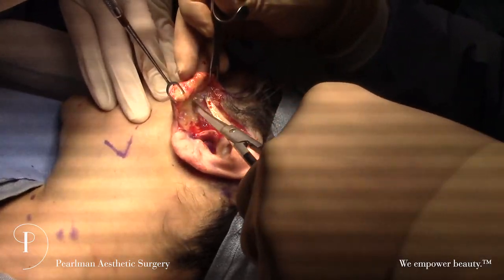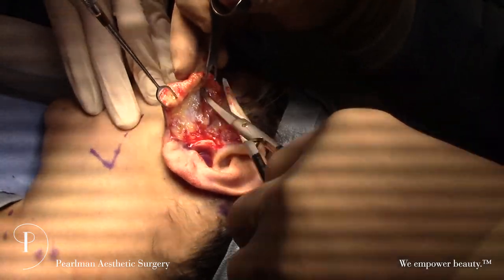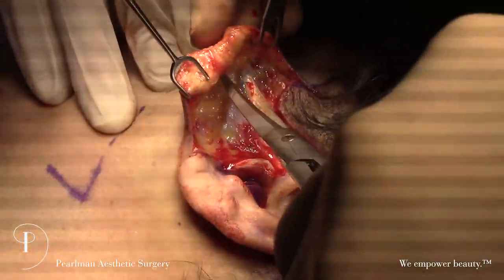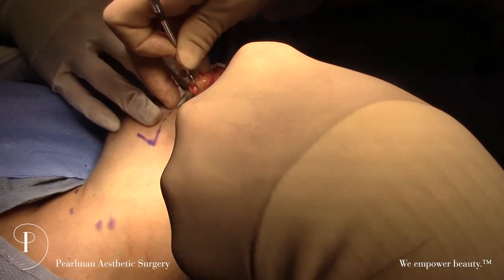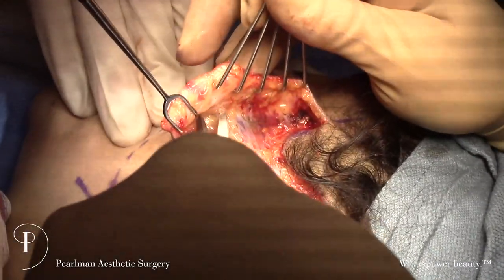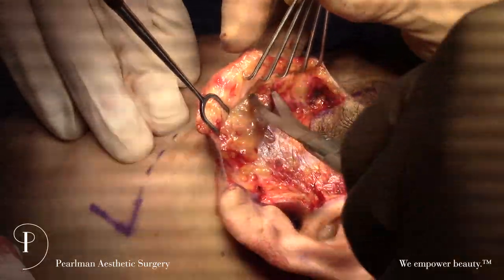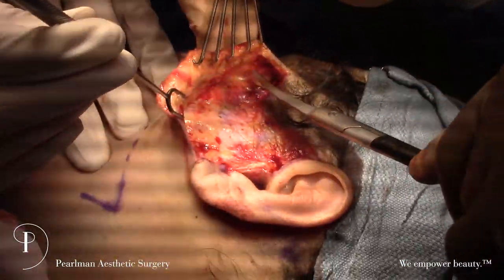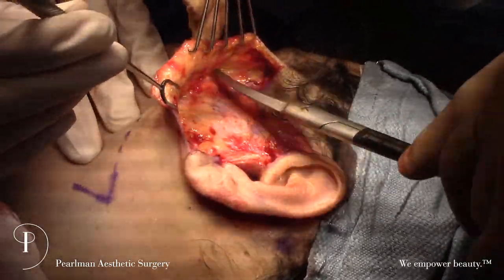We're going to lift up all of that line we made — it delineates the entrance into the SMAS for a deep plane lift. It's a little bit fat up, a little bit fat down, which tells us we're just in the right layer. Opening up gently right on top of the SMAS. There's a little bit more to go, so we'll go further down and elevate around the ear to create a nice facelift flap.